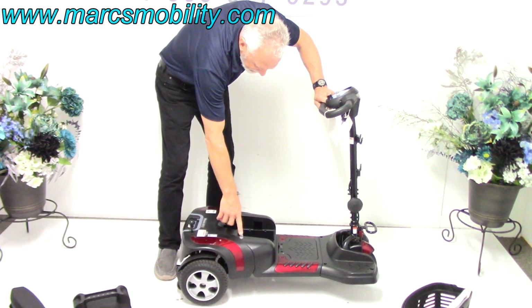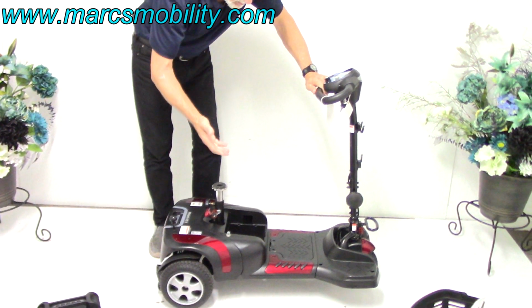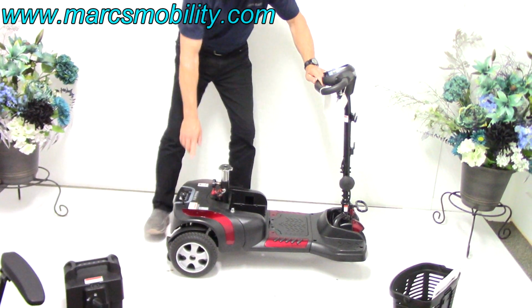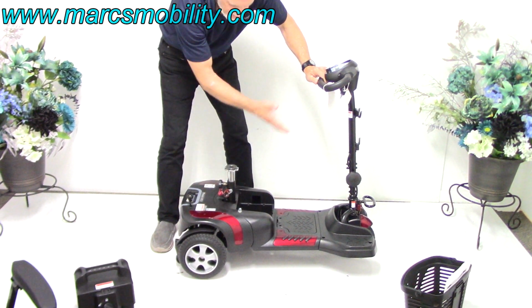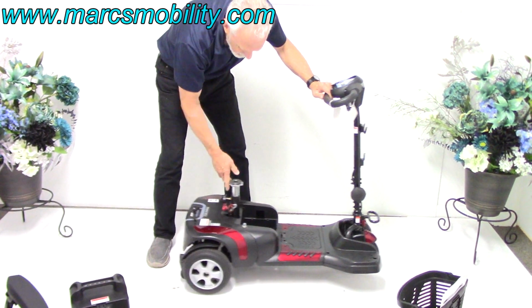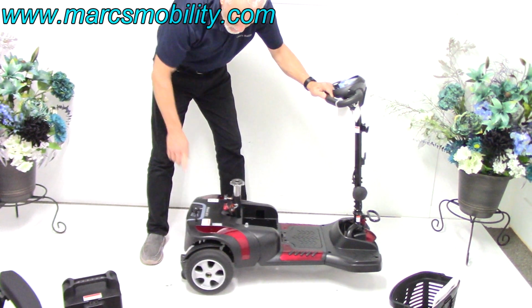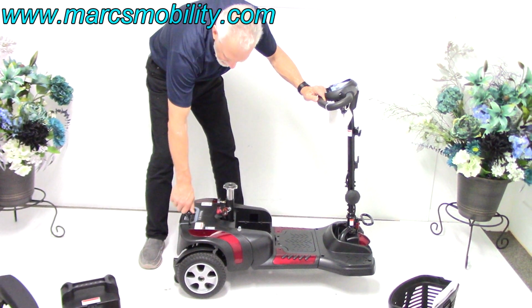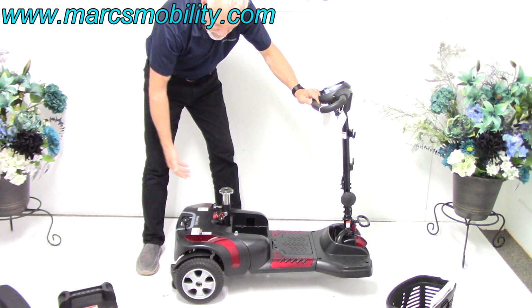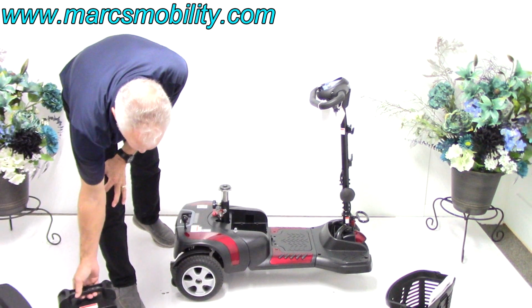You have a reset button right here. So if you got in trouble, you got stuck in the mud or something, and instead of burning your motor, this would pop out. This is your neutral. If you need to push this scooter, notice how you can't do it? If I lift this lever, it's in neutral. You can roll it around. Make sure this is always down. We get a lot of people, they change the batteries, they transport their scooter, and they put the lever up and they're all in a tizzy because their scooter just is not working.